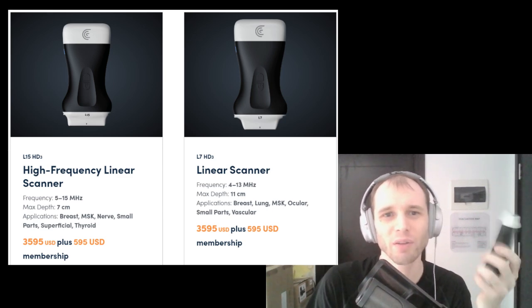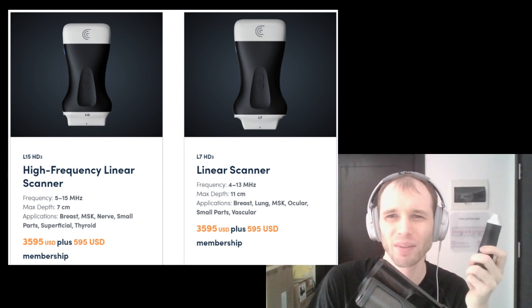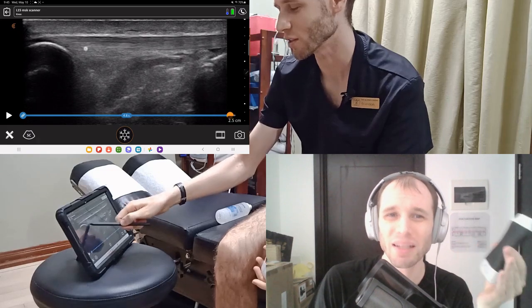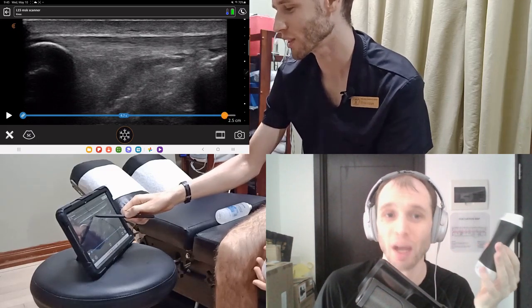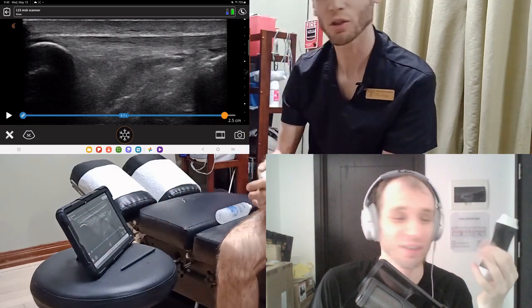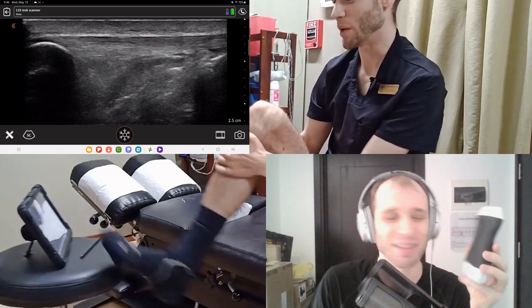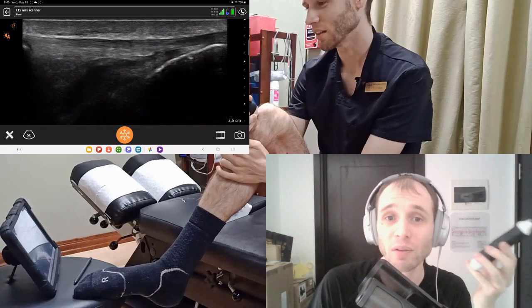Going with the L15, you only really lose out on being able to scan the hip easily. I can still scan the hip — the greater trochanter — but in a limited capacity. I have trouble getting deep enough to reach the joint capsule, for example. And depending on the habitus of the patient, that determines whether I can scan the hip at all, basically.